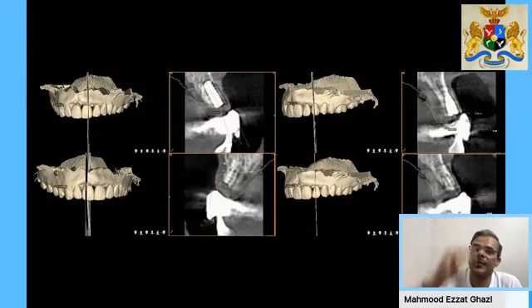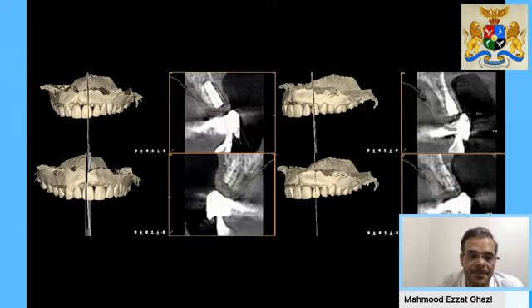And of course, the implant levels were placed at a higher level. He already had 2 implants placed, so this was another difficulty in the case. We were able to use one, and the second on exposure totally failed.